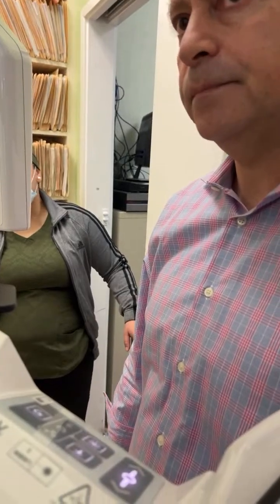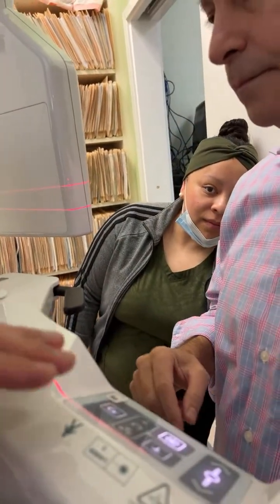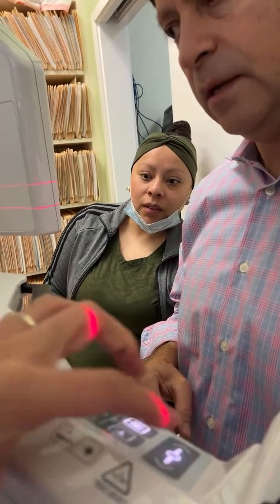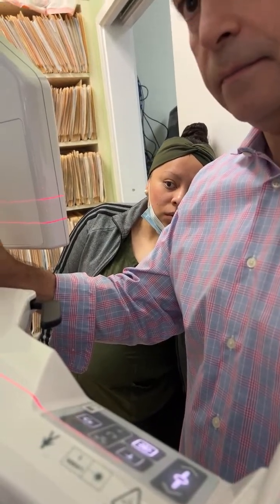Would one of you guys stand here? I just asked you a question. So to change this light, do you move this one only? See how it moves? This is 5 centimeters.